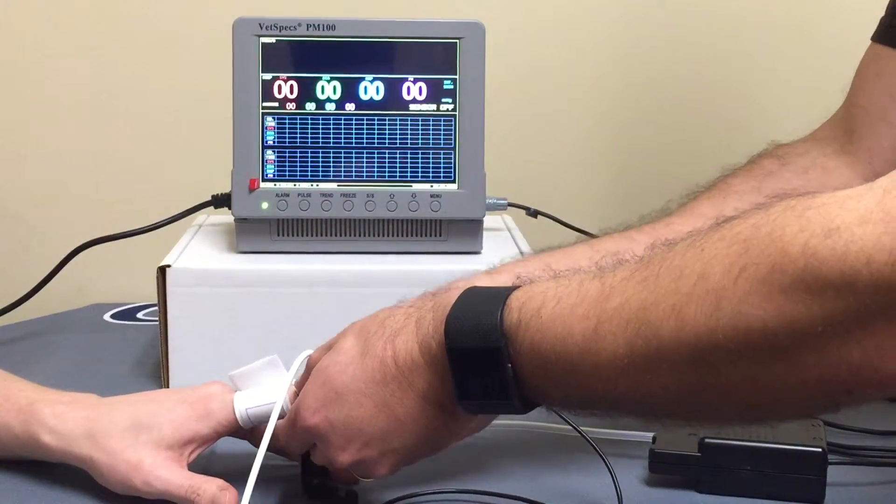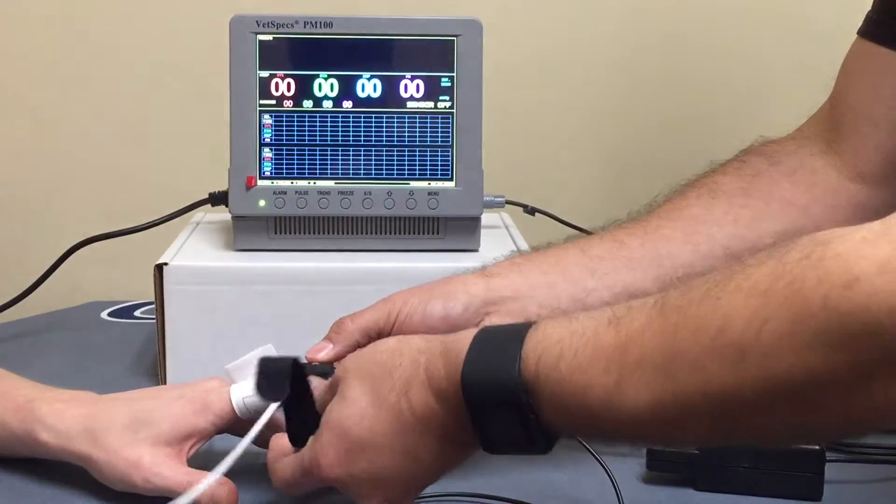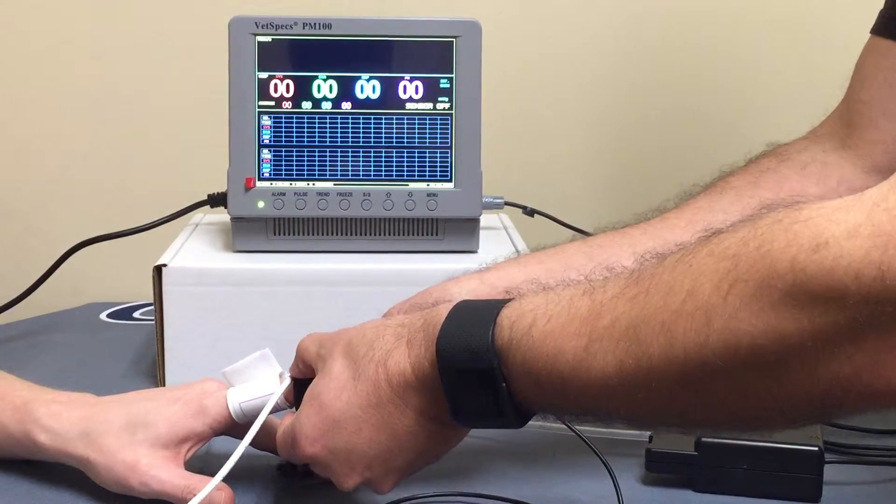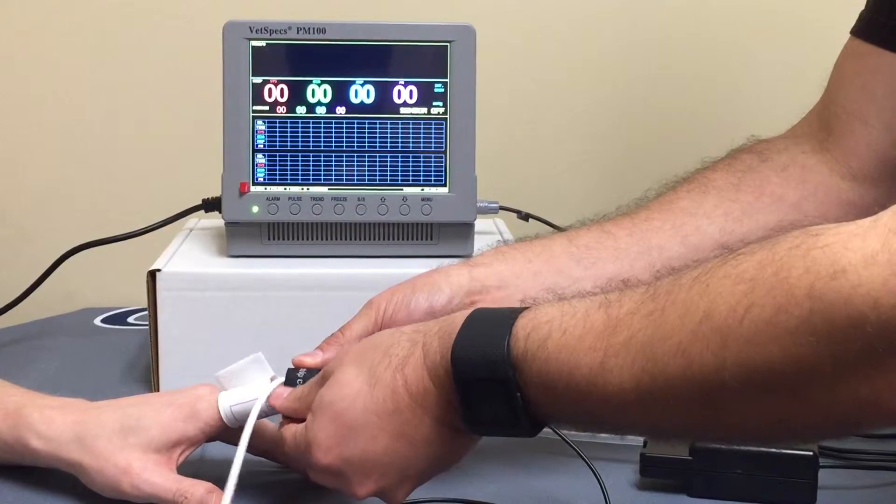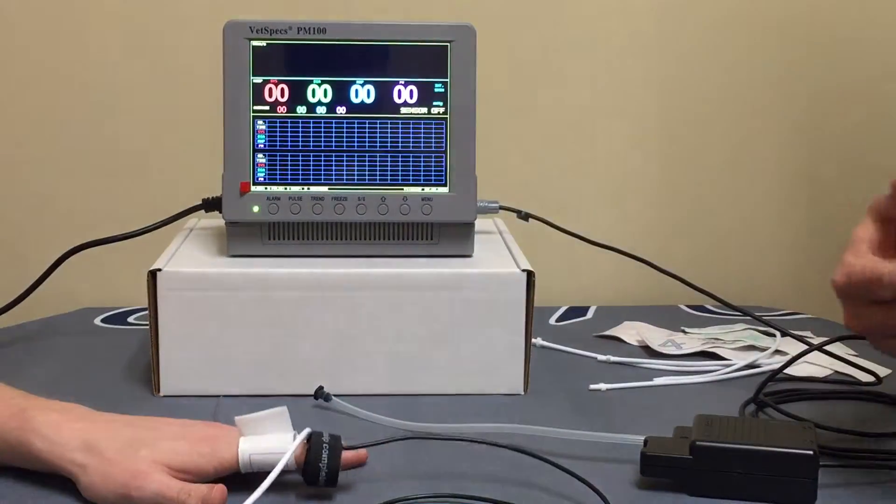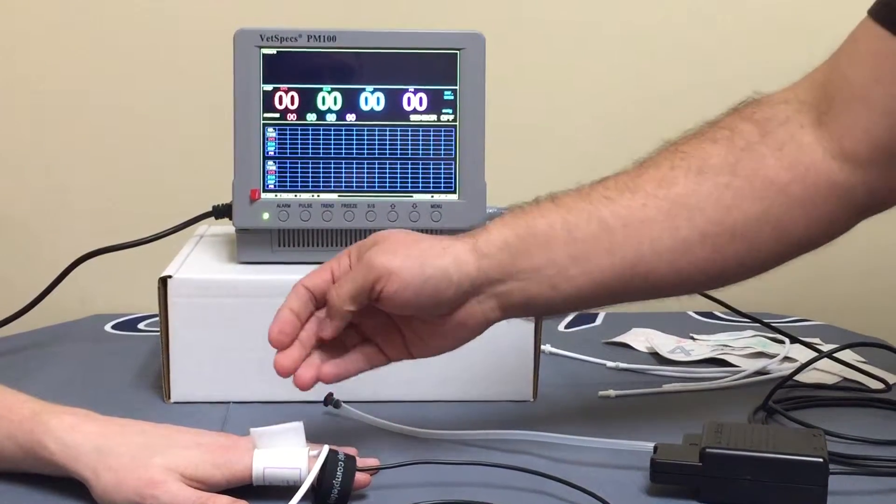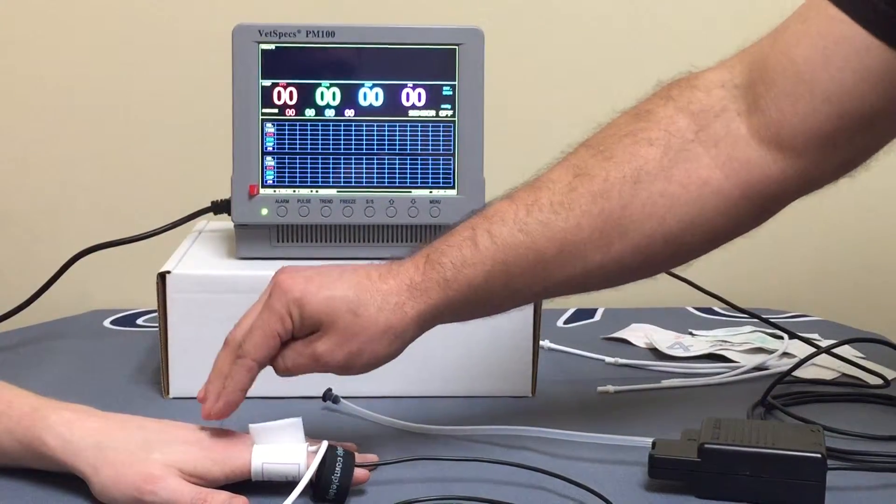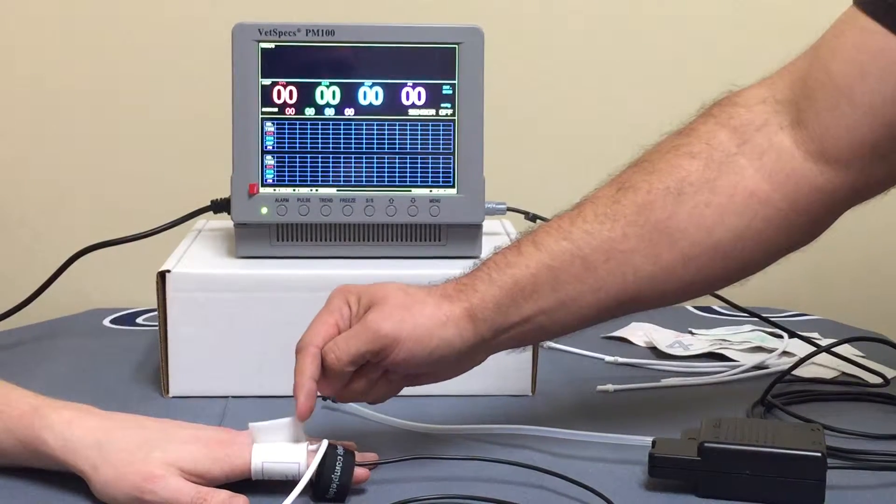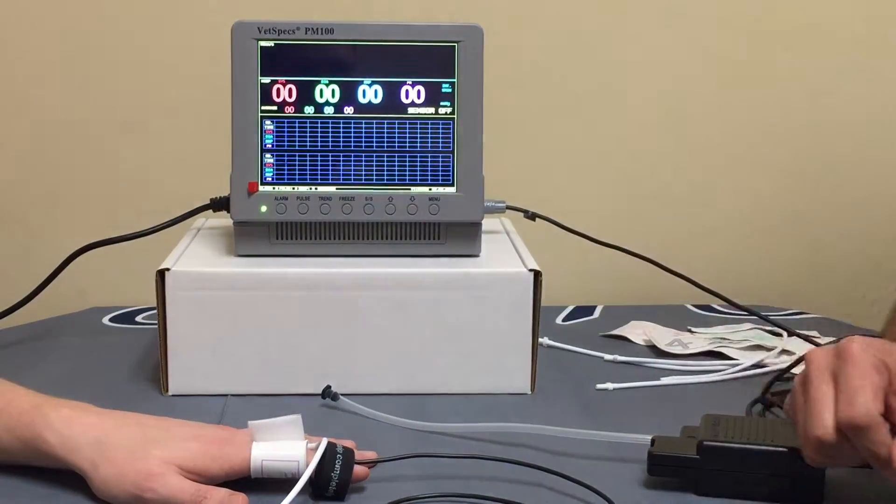So we want it snug, not tourniquet tight, but snug, so we get a good reading. Wrap that around nice and evenly. Make sure to wrap the entire velcro strap as well. That will keep that strap from dangling and causing any extra movement. So again, a patient that we're working on their tail, this would essentially be the cuff right at the base of the tail, proximal to the body. The sensor band would be no more than an inch distal to this cuff, so you don't want to have more than an inch gapping between the two.